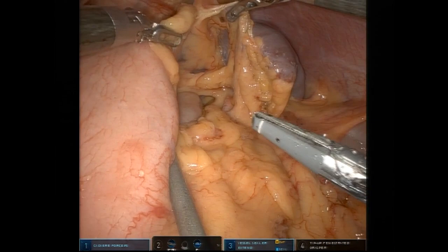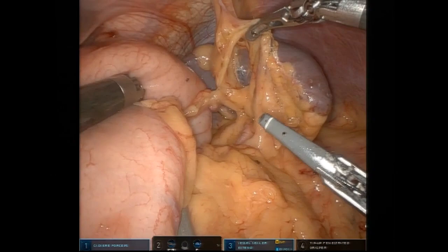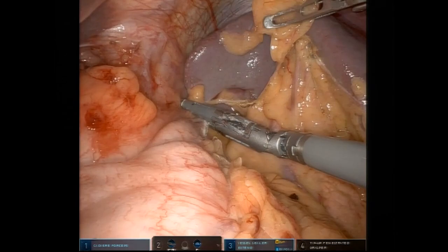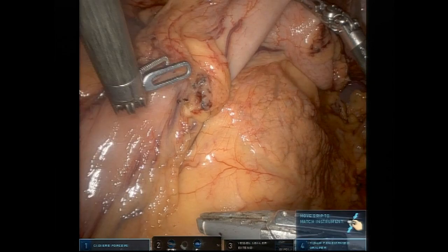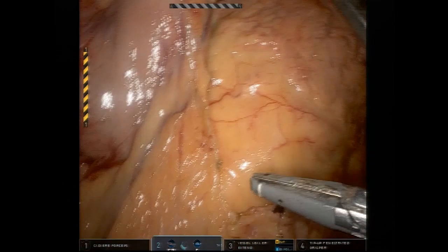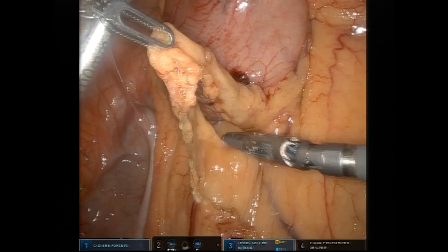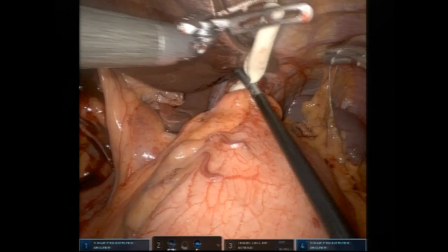Next, we take down the gastrocolic ligament and short gastric vessels. The gastrocolic ligament division is continued distally along the greater curvature. The right gastroepiploic is identified throughout and preserved. The distal esophagus is looped to facilitate further mobilization.